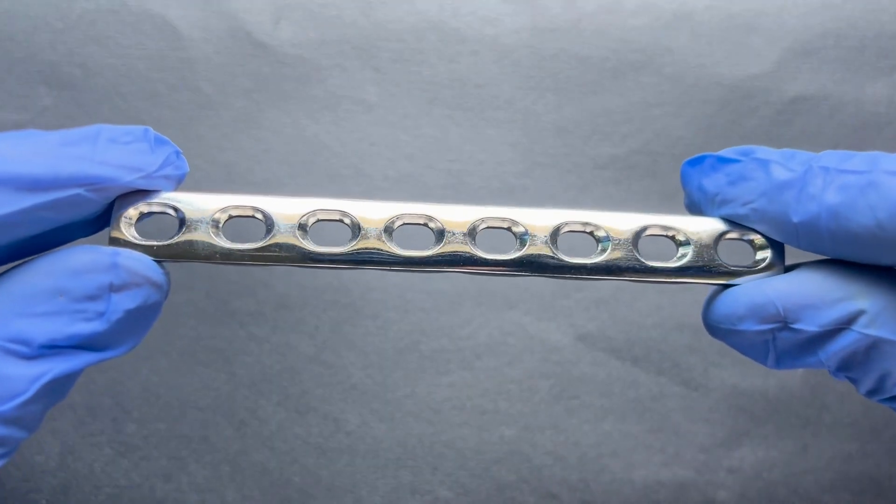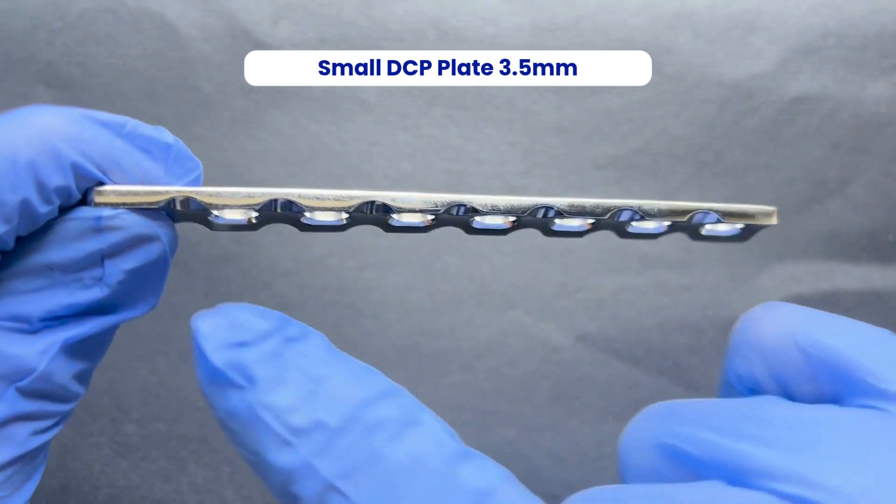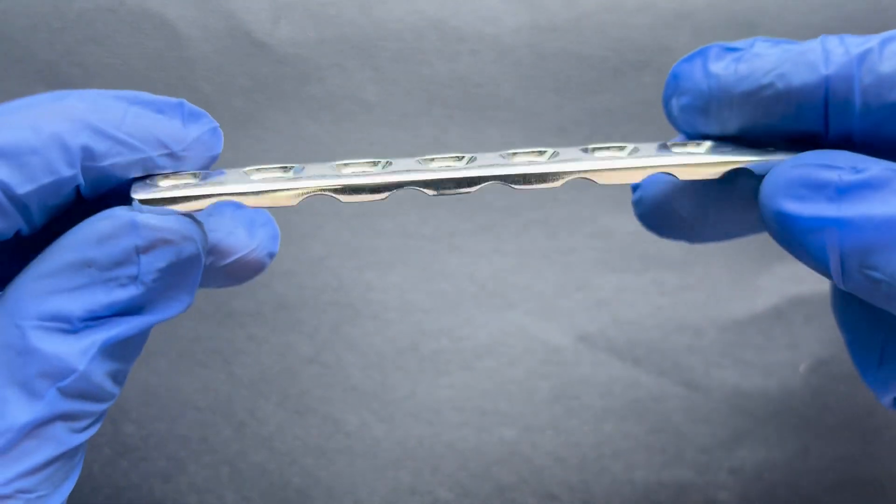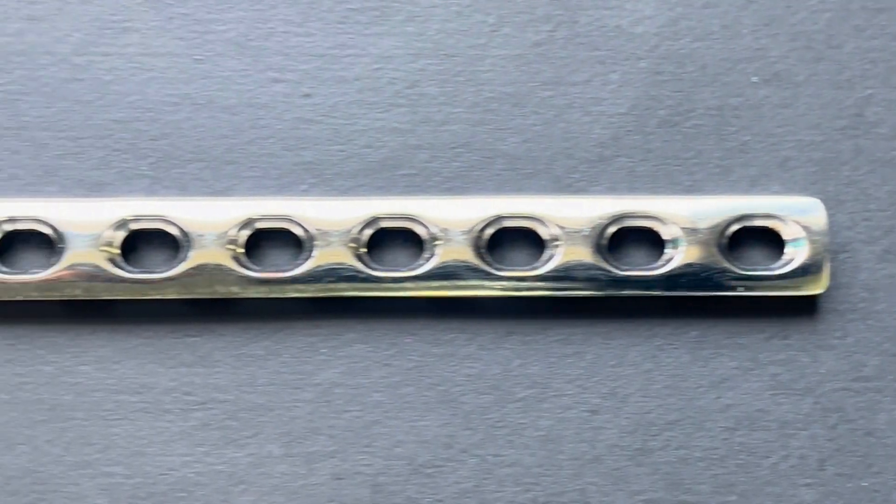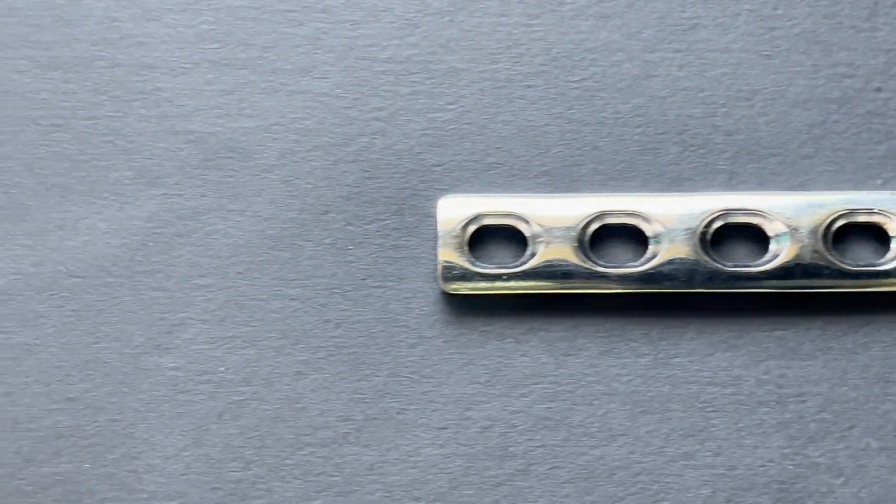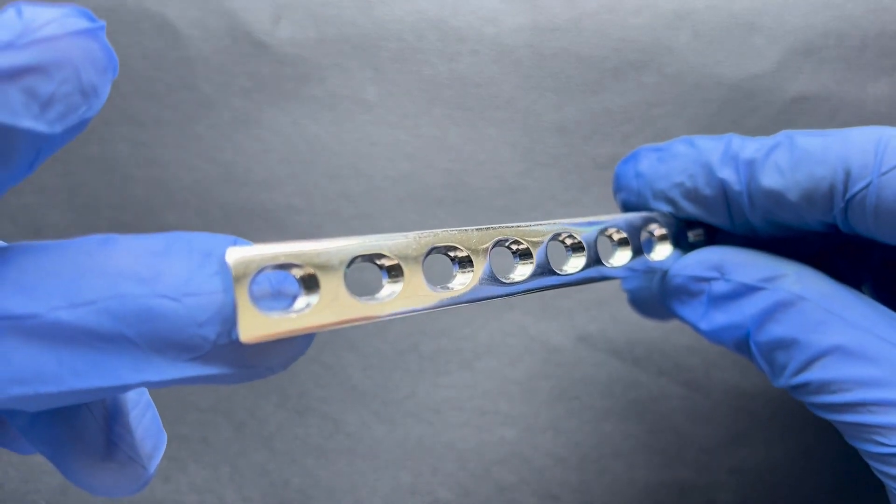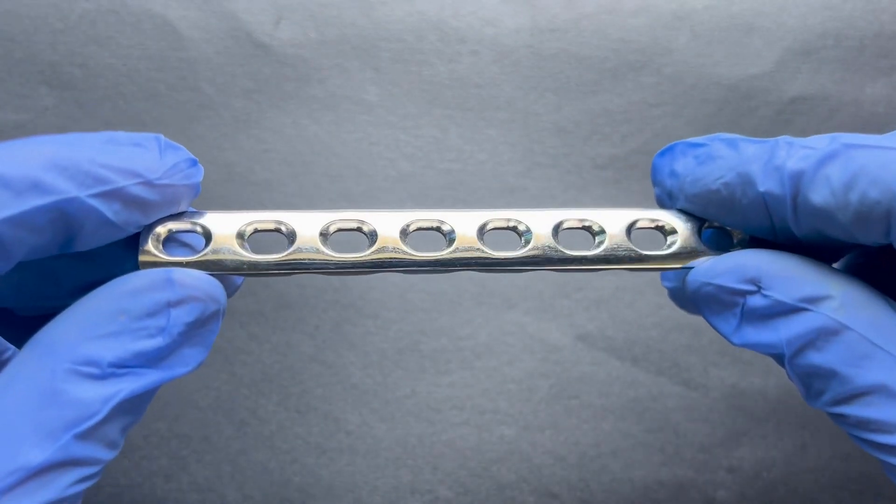Lastly, we have the small DCP plate, 3.5mm. It offers straightforward dynamic compression for various fracture patterns in smaller bone segments. Its design ensures reliable interfragmentary compression and stable fixation.